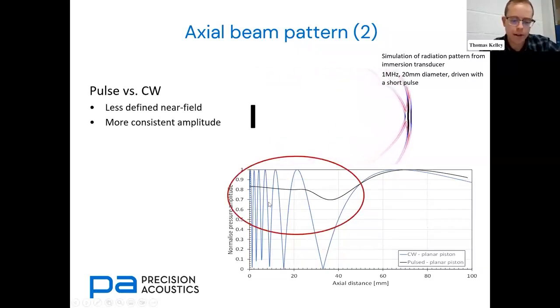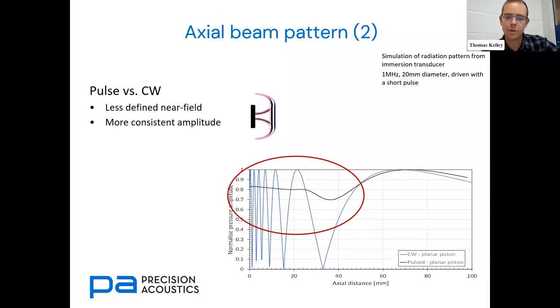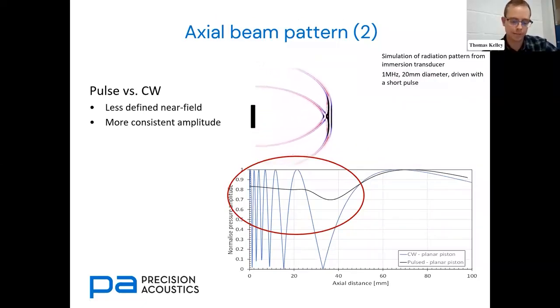So there's not really the same near-field, far-field distinction. This is related to the interaction, or lack of interaction, between the main plane wave and the diffracted waves from the edge of the transducer. But in summary, you can influence the field shape by your choice of drive regime. So that's the takeaway when considering designing a transducer here.